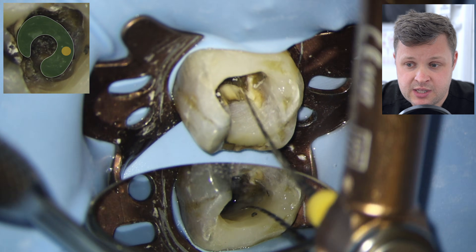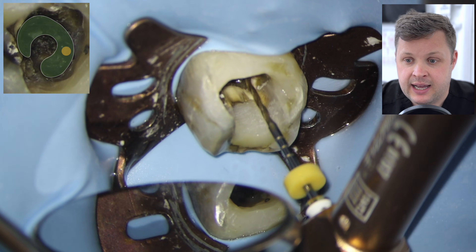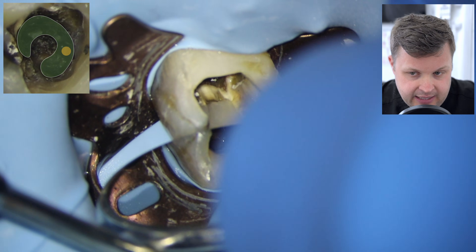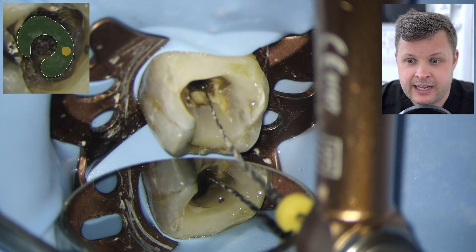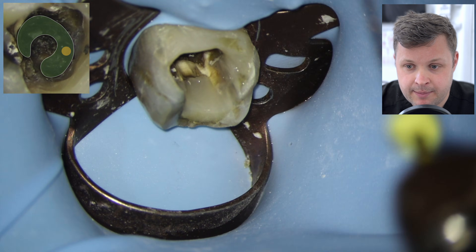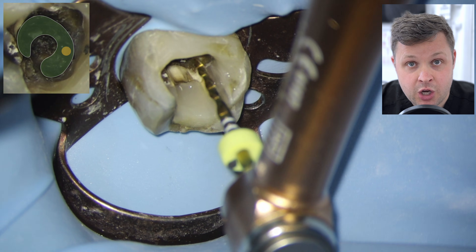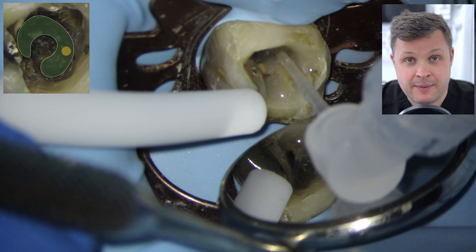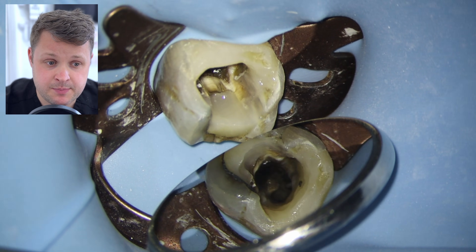This wasn't expected because I couldn't see it on the CBCT — fantastic. I'm using the HyFlex 15 to open up this mesiolingual canal orifice. I don't want to take it down too far and ledge the tooth. The HyFlex 15 was shaping quite easily, so I check the working length of this mesiolingual canal and get a zero reading. I'm not jumping straight to the size 25 HyFlex as I did with the distal — I'll step up file diameters, using a size 20 WaveOne Gold file to avoid ledging.